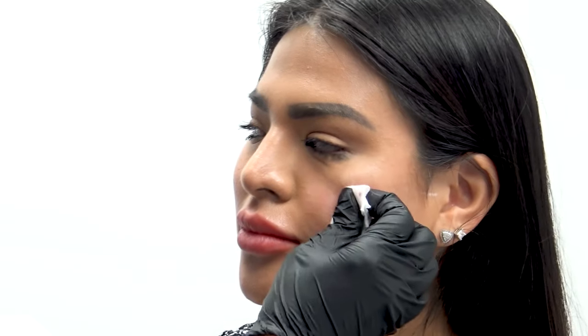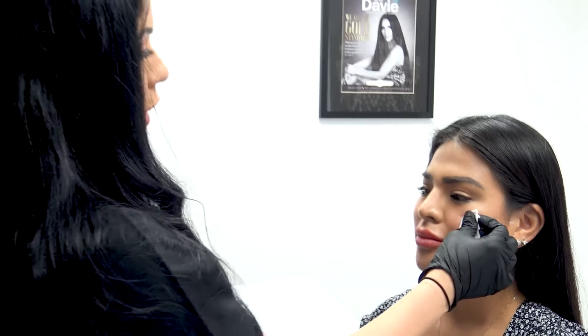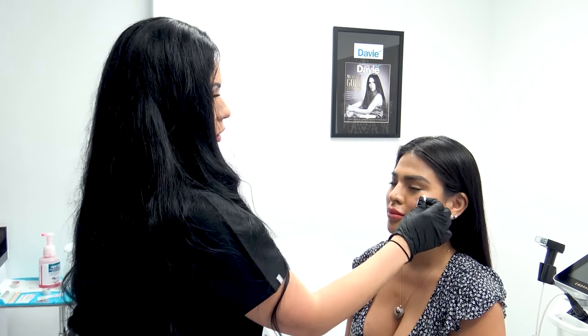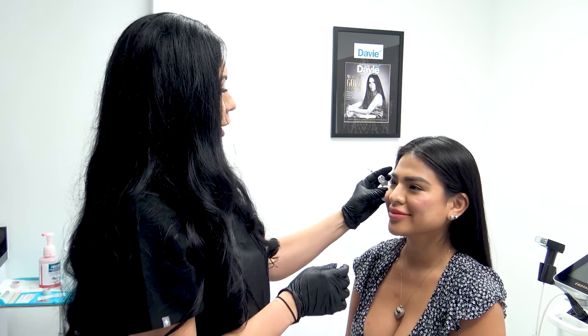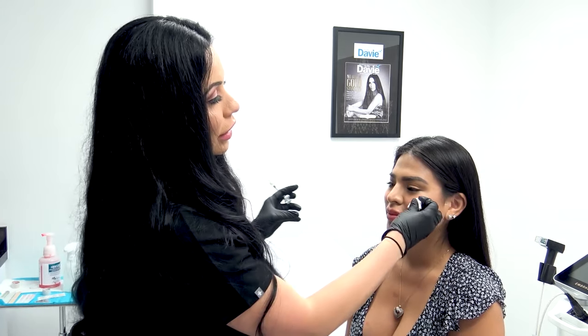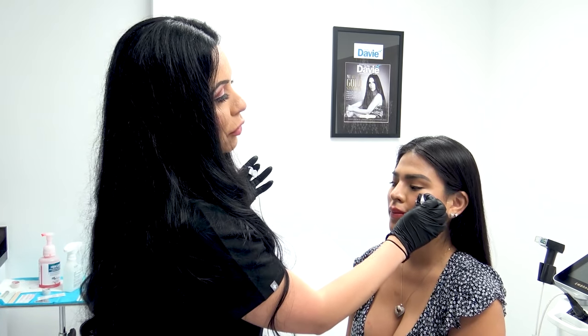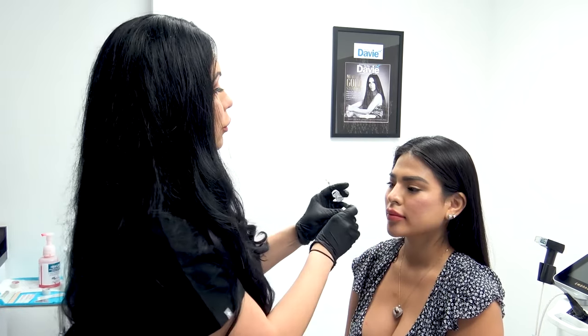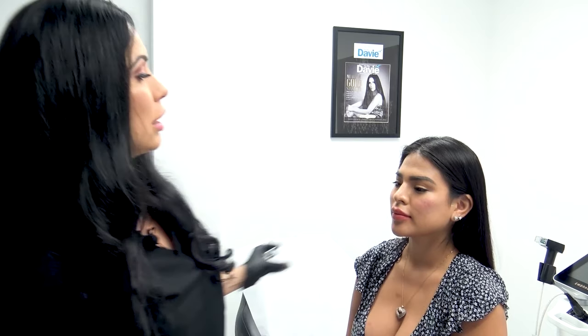I'm actually going to go a little bit lateral just to make her a bit more symmetrical, and we are done. I always tell my patients: tonight I want you sleeping at a 45-degree angle — that's so tomorrow there's not a lot of swelling associated with the filler. Try not to touch it or massage it; I want it where I put it. The filler doesn't really become permanently set at the site for about two weeks, so you don't want them sleeping on it. If you can sleep on your back tonight or for the next few days, that would be greatly appreciated.